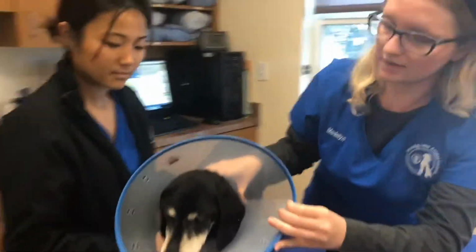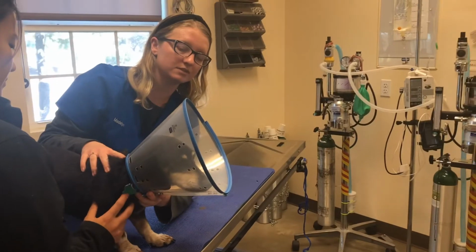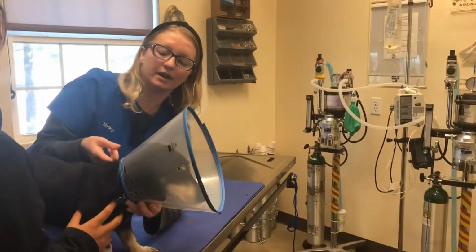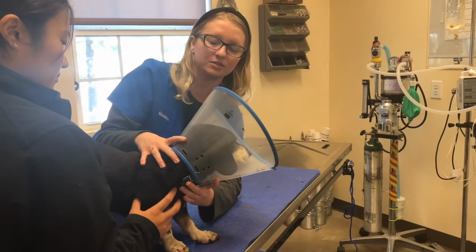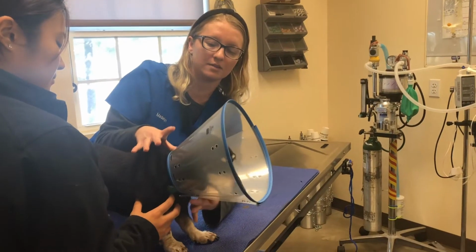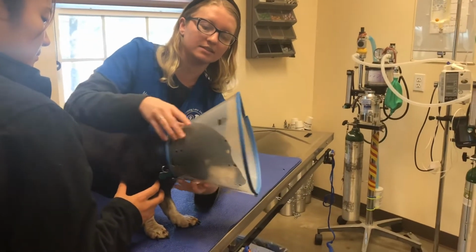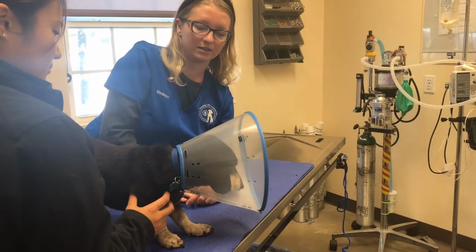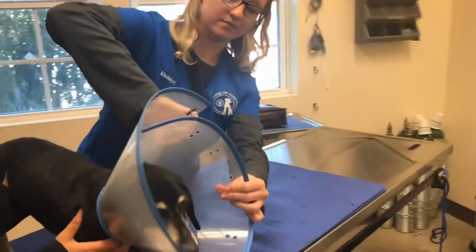So I know that this is the right size e-collar for him because it extends past his nose. That way if he's trying to lick or chew at something, he won't be able to access it. I also can slip 2 fingers underneath the e-collar, which tells me it's not too tight to where it's restricting his breathing or making him uncomfortable. It's also not too loose to where it just budges over his head to where he kicks it off. So it's the appropriate size e-collar, and it's been applied correctly. And then to take it off, you just unclamp and it releases.